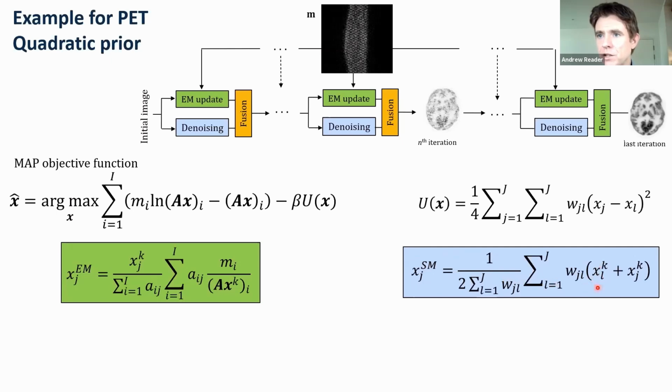We're saying, take your current image estimate xk, so that could be here. And then look, we're doing a neighborhood averaging. This is just like a convolution. Look at that, that's just a matrix W multiplied by X. So these weights are saying how important the neighborhood differences are. Imagine that as a Gaussian kernel, something like that, that you might use in a convolution operation, for example.